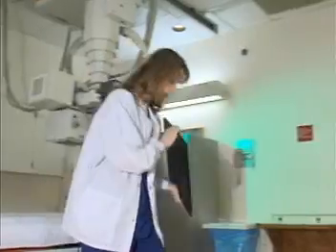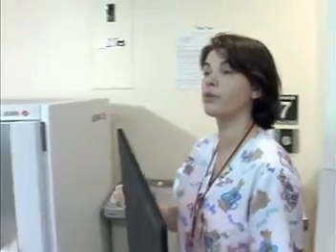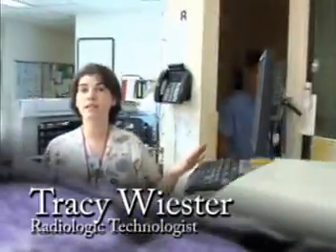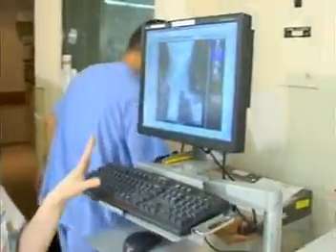Once we're finished with the x-ray, we take our x-ray plate and take it back to where we identified it to process it. Once the x-ray has been taken on the cassette, it is then placed on the digitizer or processor where the image is developed. Once the cassette is run through the digitizer, it then appears on our monitor where we're able to visualize the image and make any corrections needed.